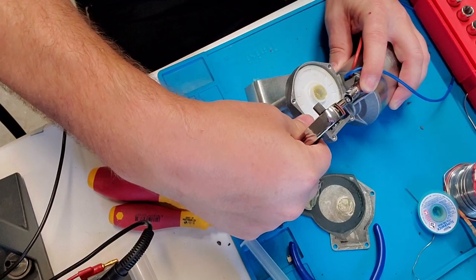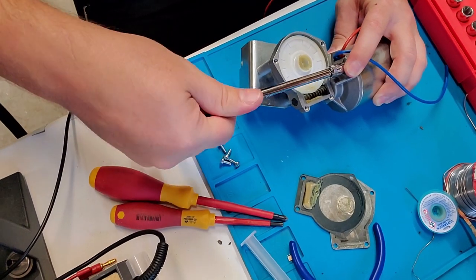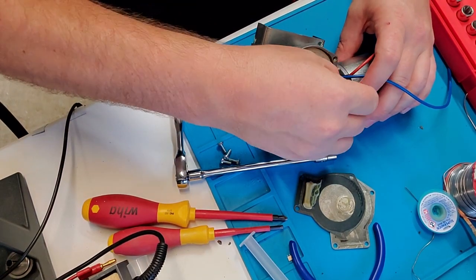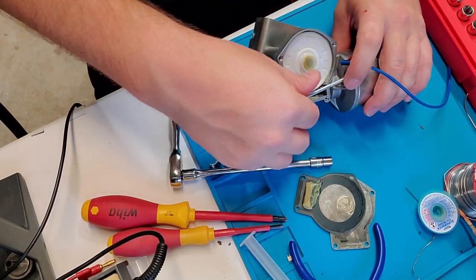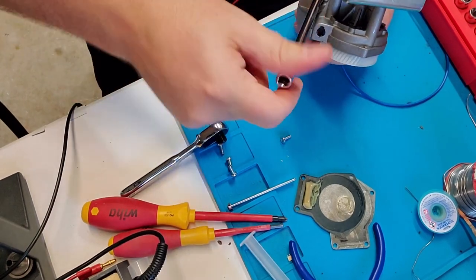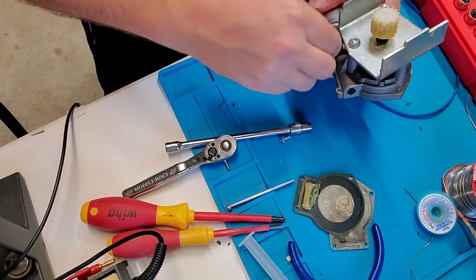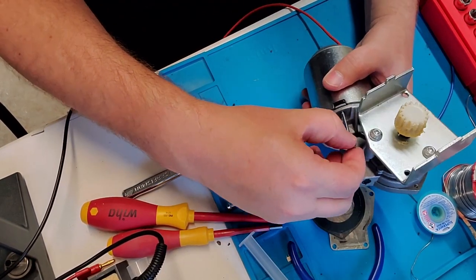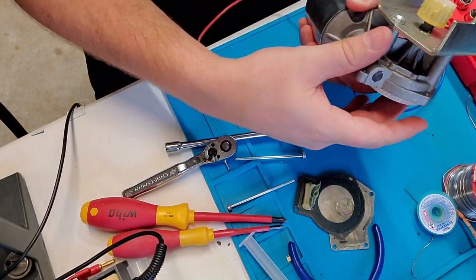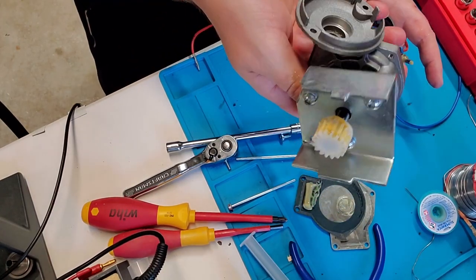That's what I'm talking about. So this should be a regular brush DC motor. You can almost smell the electric smell when you get down by the brushes. All right, so there are only two fasteners that slide all the way through and hold this thing together. They screw into the end cap. All right, that's the transmission. Nice light aluminum casting.